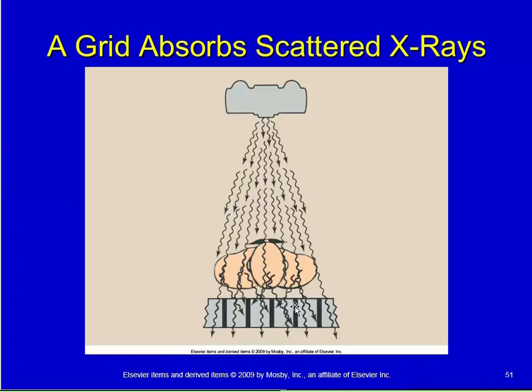It's what we call grid lines because they are the lines of the grid. But if we could take this grid and make these individual strips half as thin but put twice as many in, then our grid ratio remains the same, but we've got thinner grid strips more often.